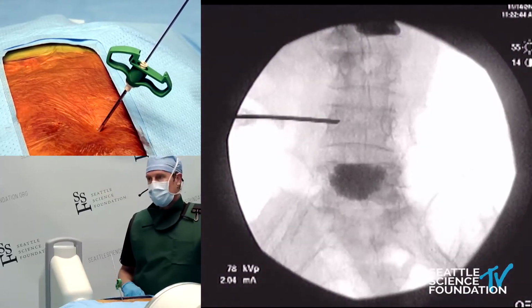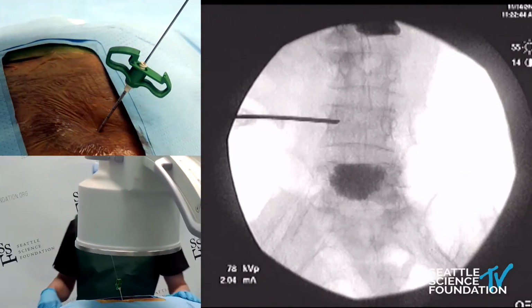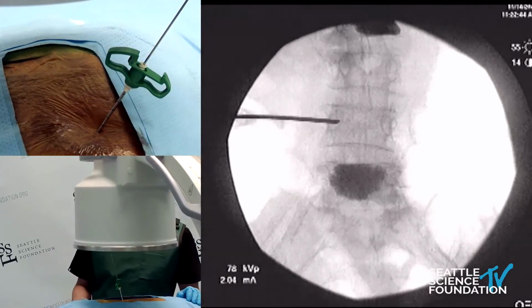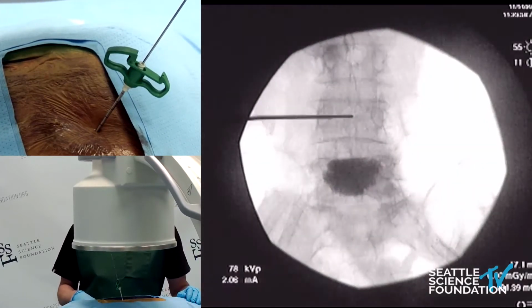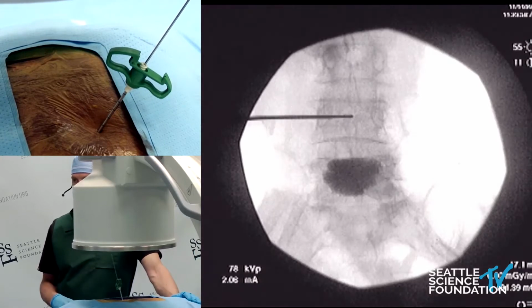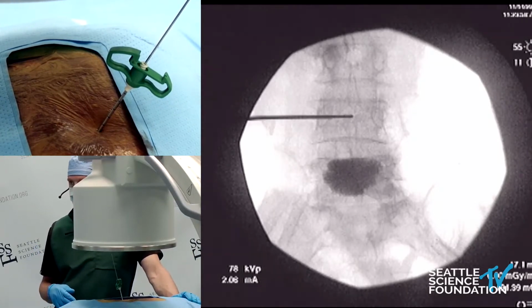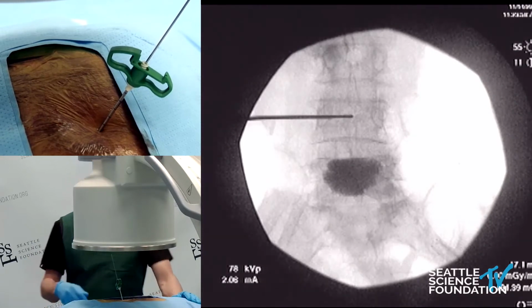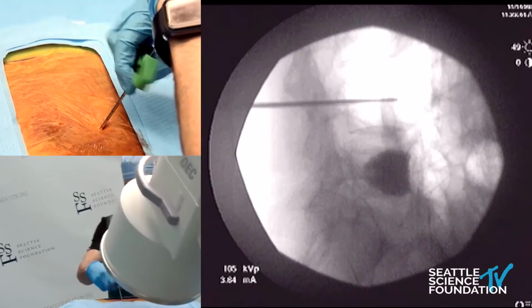And what we do there, by recording that, will be the final resting position of the jack if we don't make any modifications. And I hope it's slightly off. No, it's not. So that's pretty spot on. But I might switch it around whenever we do the reamer, or hopefully we'll be slightly off on the other side. But that is spot on. Let's go lateral. So I'll remove the cannula.